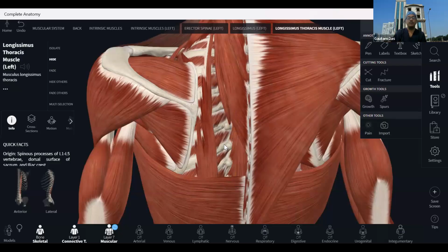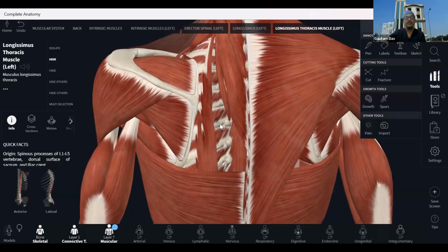So when you are holding the probe, if you wish to identify each and every muscle layer of the erector spinae group of muscles, you identify just above, the very bulky muscle is your longissimus, and medial to that are two layers. One is your spinalis, below that is a multifidus, and lateral to that is your iliocostalis. Okay. After that you'll be having the rib and the intercostal muscle and then the pleura.